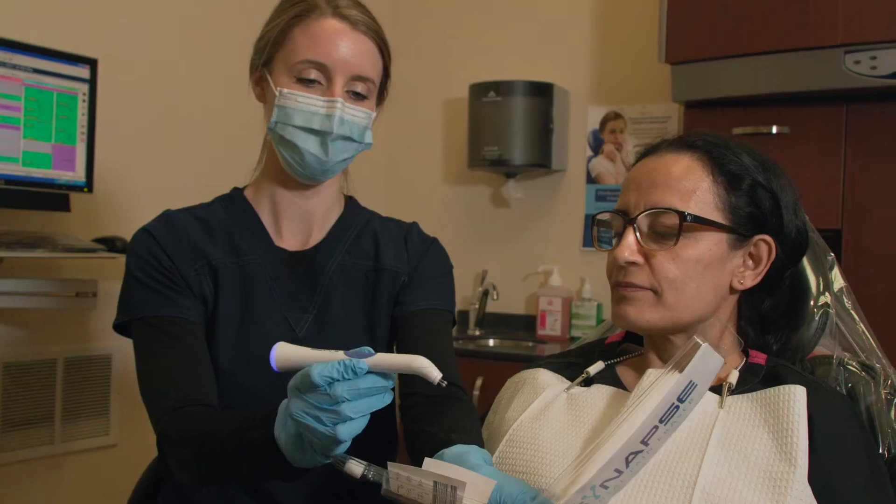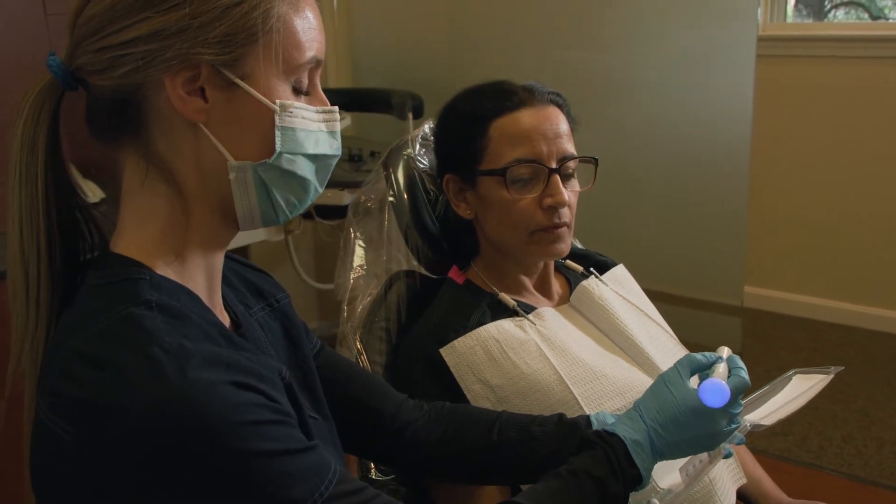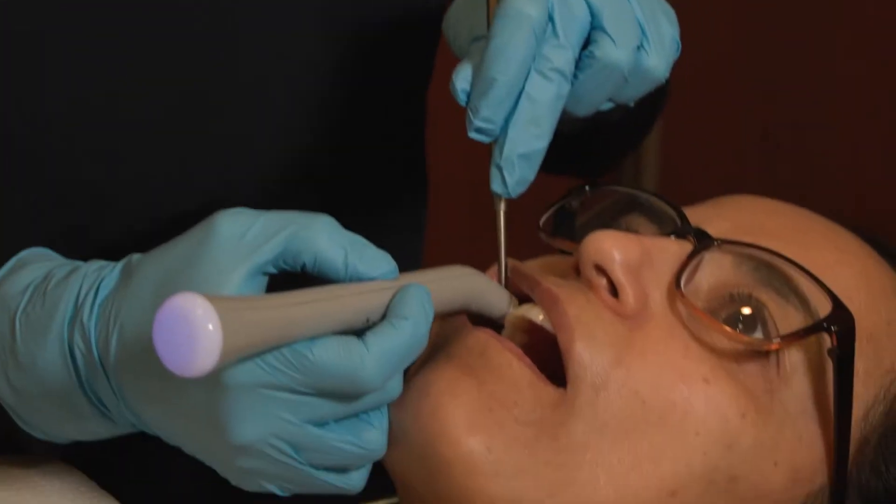The Dental Pain Eraser has changed the way that I practice hygiene because I don't have patients fearing coming to see me anymore. They're not afraid of the discomfort or the fear of having a needle before a deep cleaning. They know that I'll use the Dental Pain Eraser and it's going to be a comfortable experience.